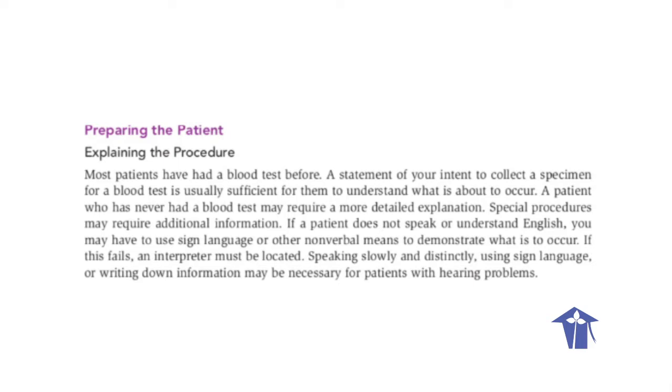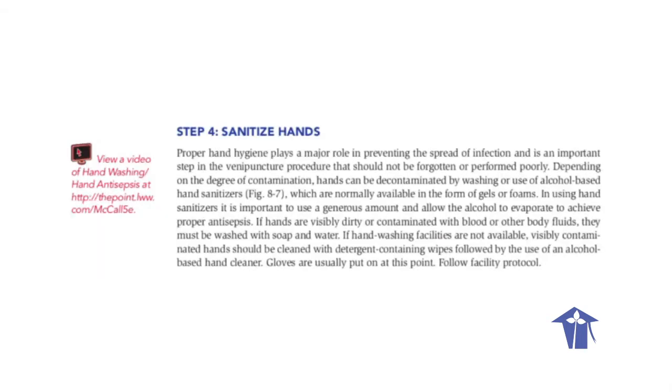If a patient does not speak or understand English, you may have to use sign language or other non-verbal means to demonstrate what is to occur. If this fails, an interpreter must be located. Speaking slowly and distinctly, using sign language, or writing down information may be necessary for patients with hearing problems. Step 4. Sanitize hands.